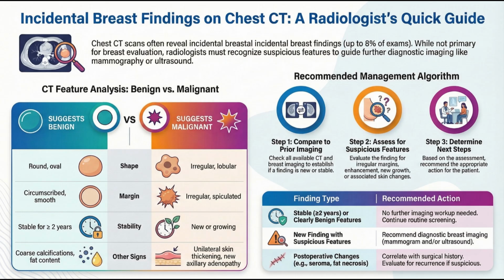If it's an intracapsular rupture, meaning the leak is still contained inside that fibrous capsule the body forms, you might see that classic sign. The linguine sign is a fantastic description. You literally see the collapsed, wavy implant shell floating inside the silicone, like a bag of pasta.